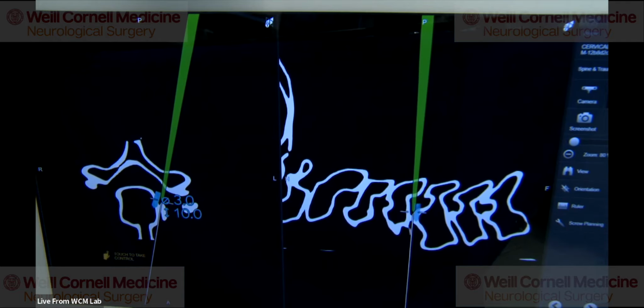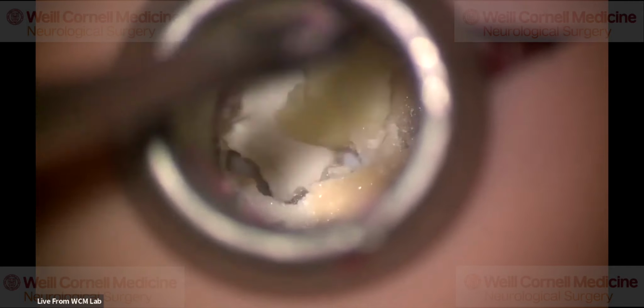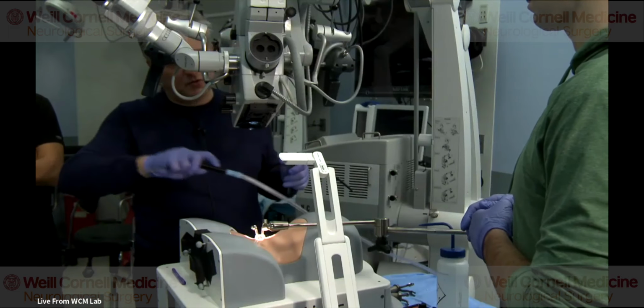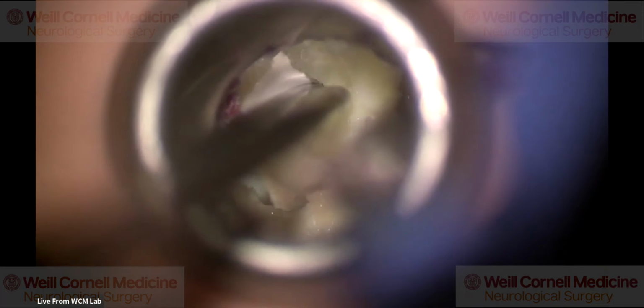I'm right where my target is. So that's good. Now I want to find the pedicle below, because once I have the pedicles, I know where my nerve root is. The nerve root is going to be in between, for the most part. I mean, always.